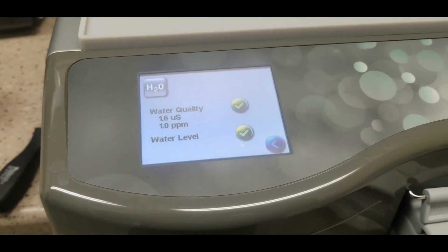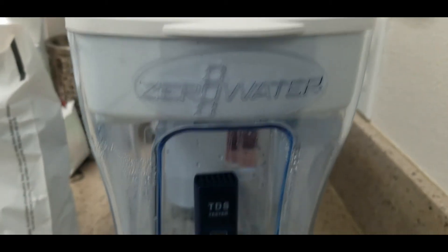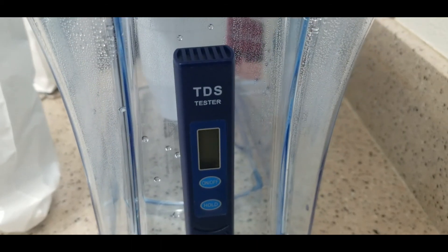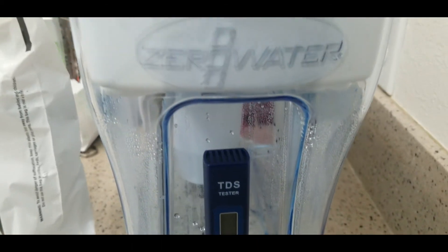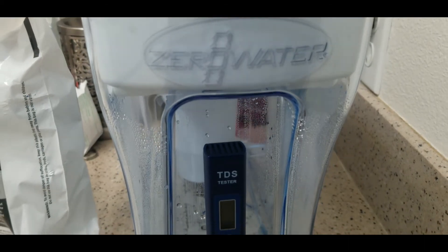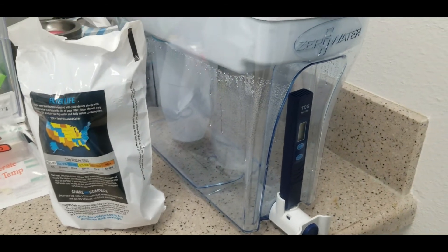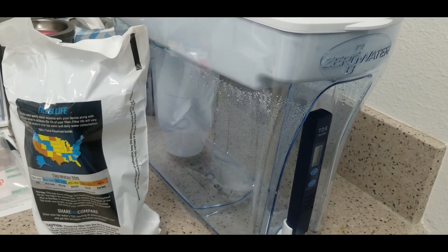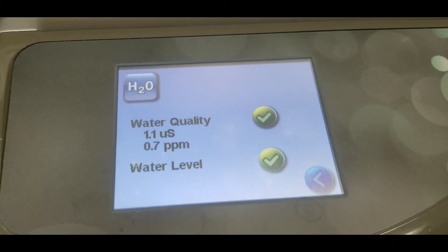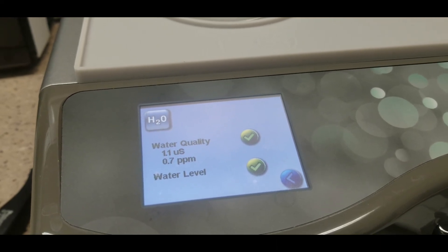When I bought this zero water filter I also bought a separate TDS water tester to verify the included one isn't reading incorrectly. It is a legitimate total dissolved solids tester — it came with the same results as one I bought independently from a different seller unassociated with zero water. As I added more distilled water to the tank it diluted the reading from one part per million down to 0.7 parts per million, and running it through again will eventually get it down to zero.